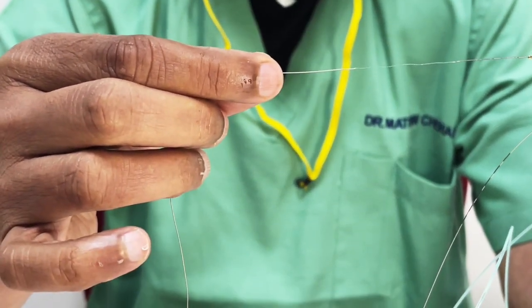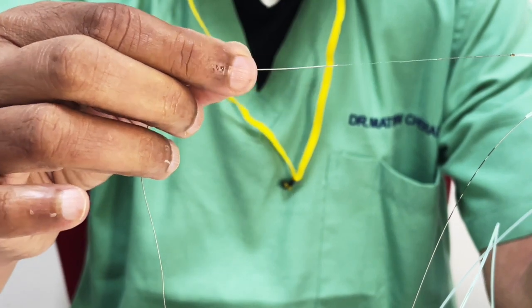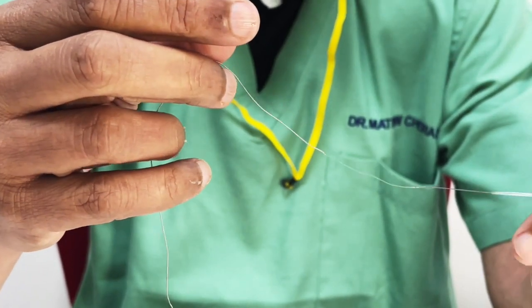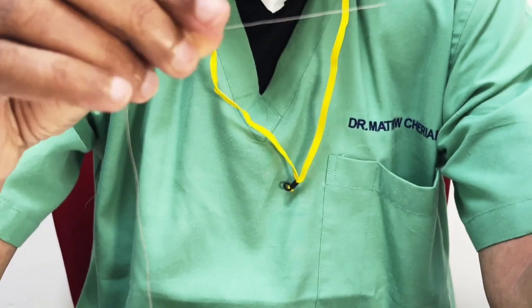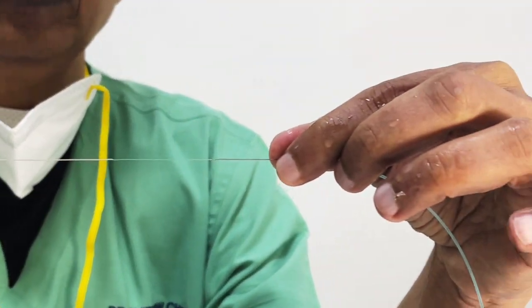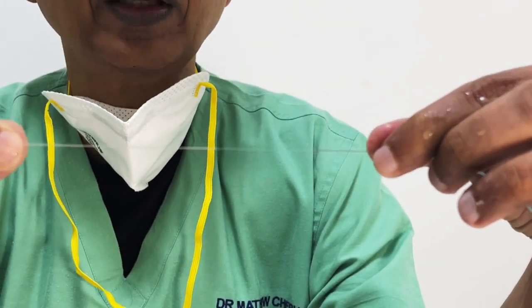Now see, it's very important to understand an important factor here. At one point of time, stretching was a big issue. So when you start manipulating, this segment would stretch. But today, after stretching, it stops. It's very important to understand this. Can you see that? It doesn't stretch further. Now, this is called a stretch resistant or an SR coil.